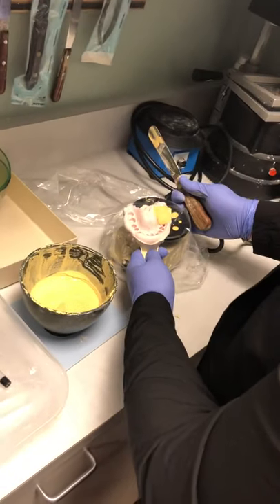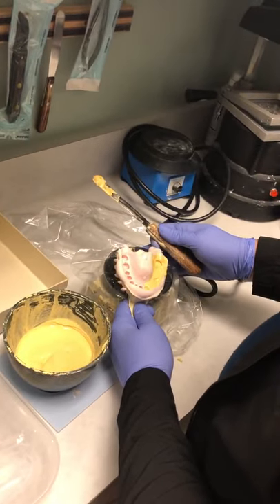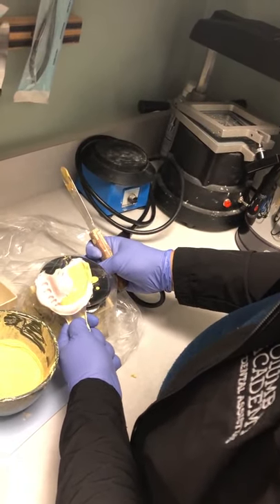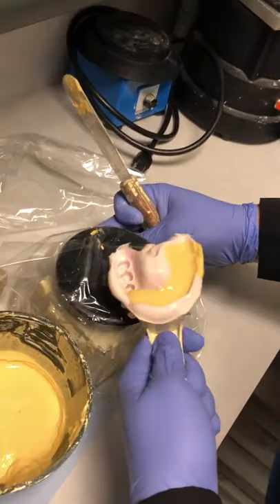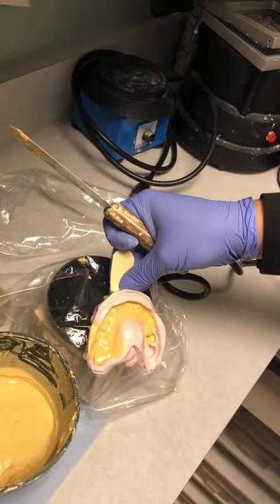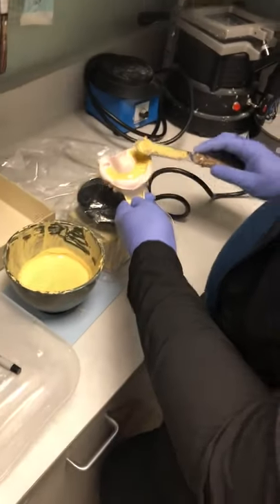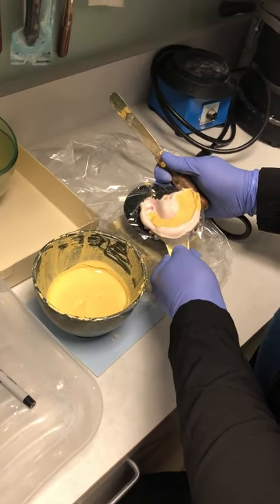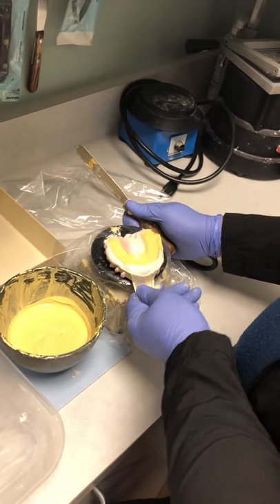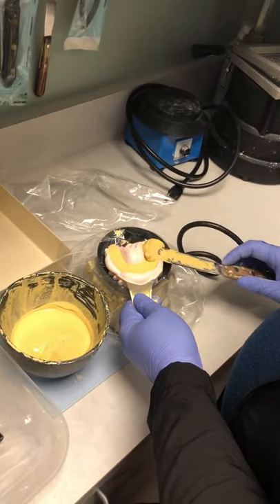Same thing for the maxillary — let the stone flow all the way around. You don't want to start adding to both sides at once. It's starting to thicken a little, so I'll add a bit more to try to reach all the way to the last molar. Just let it sit here to get those bubbles out. Once it looks good, one more go around, and then we're ready to build the bases.